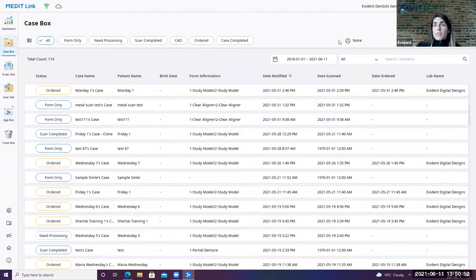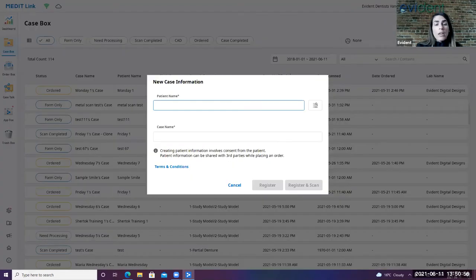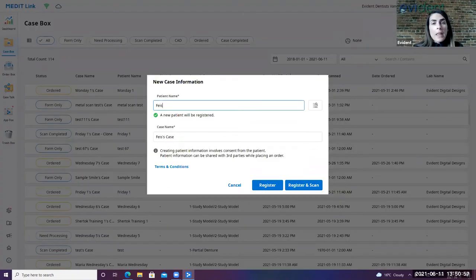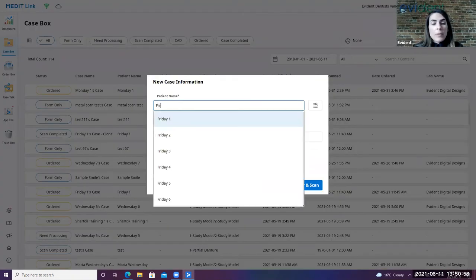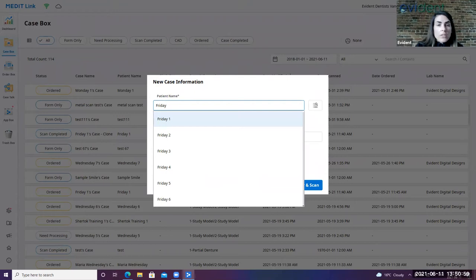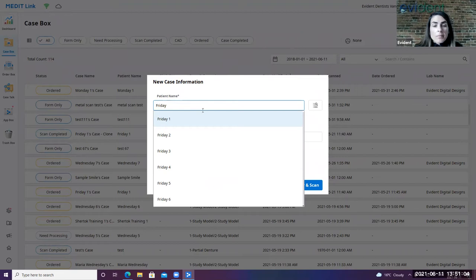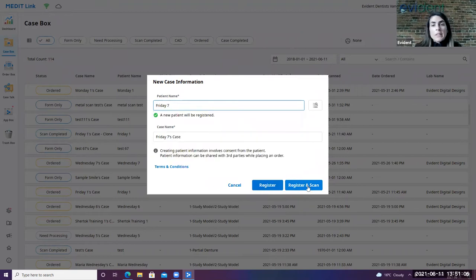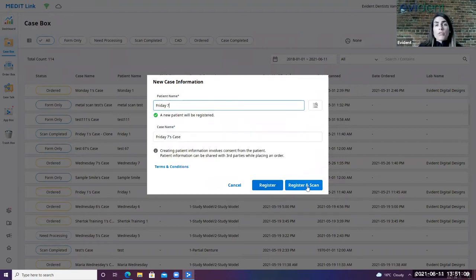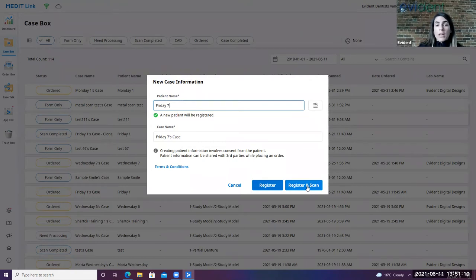So for what we're going to do now is I'm going to go ahead and create a case. So I've gone back into the case box. I'm going to select a new case. I'm going to type in a patient, we're going to call this Friday 7. And we're going to go ahead and register the scan, which will allow us to see a form, register the patient, and also get us prepared to do our scan.